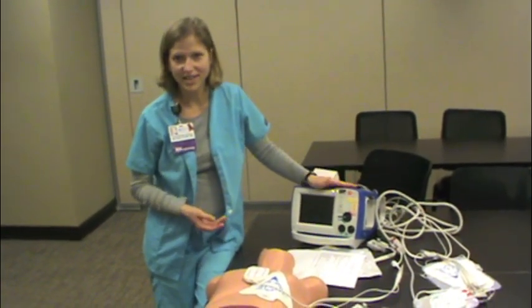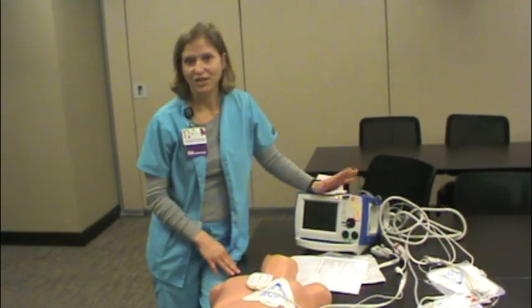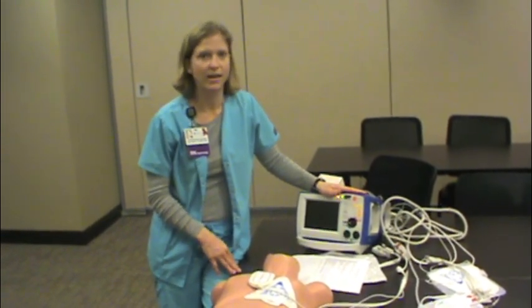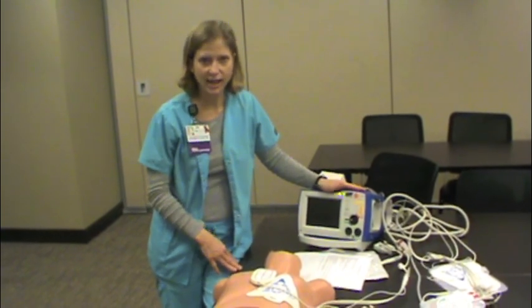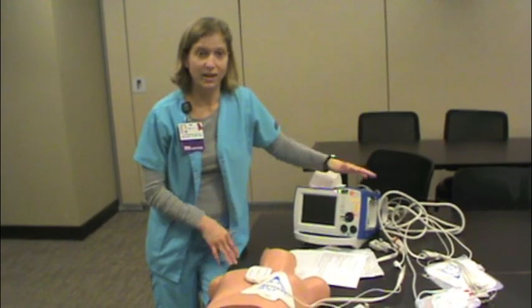That's our new Zoll R-series defibrillator. If you want more information, there's a Healthstream module — you can sign up on Healthstream for Zoll's online training. It's put together by the company and it's very good and very in-depth.